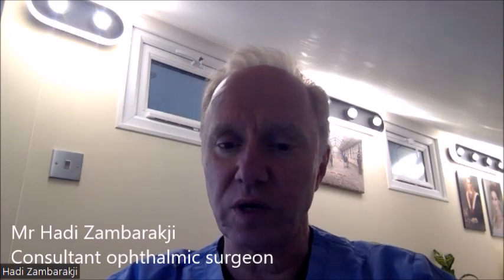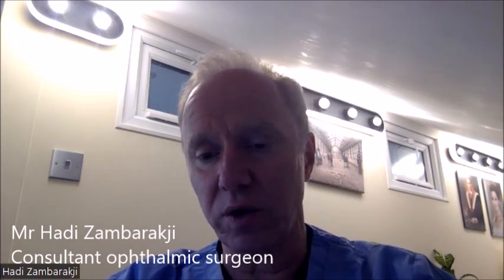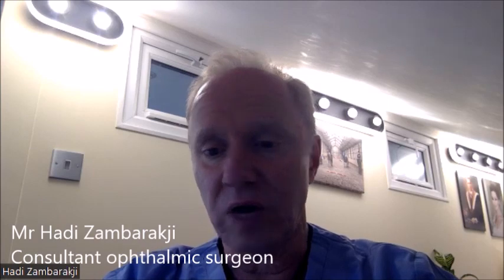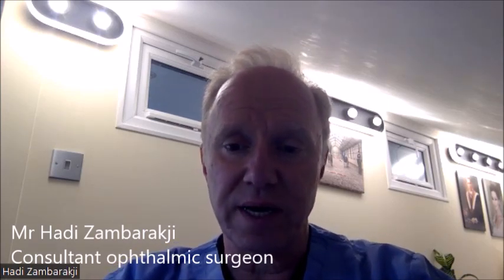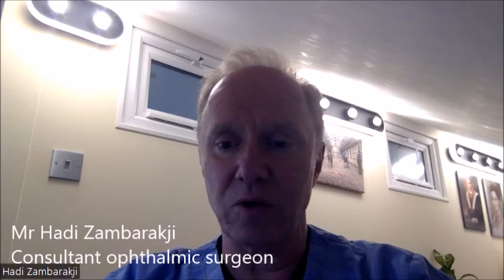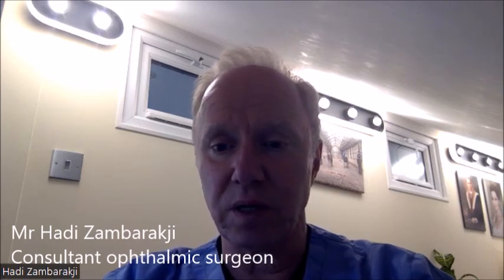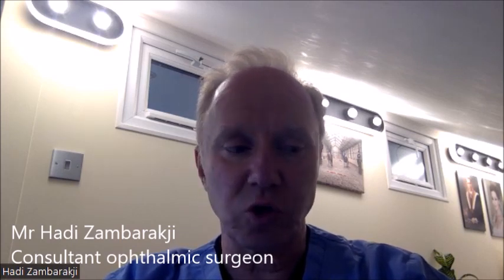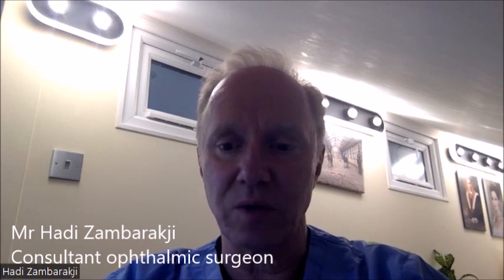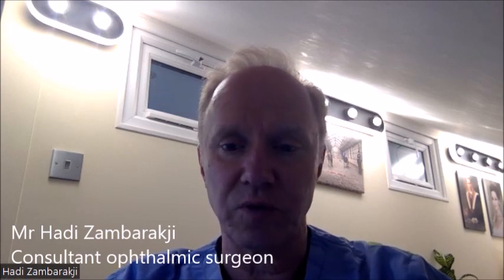What does the patient do for a living? Are they still working? Do they drive? Do they drive in the dark? Do they drive at night? Do they drive for a living? Do they spend most of the time outdoors, or do they spend most of the time on a computer or on a PC? So the choice of the right lens really depends on the patient, and I really do not have a preferred lens.